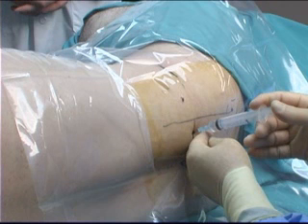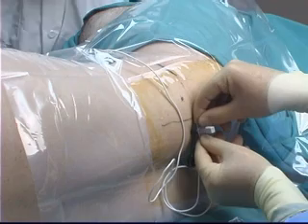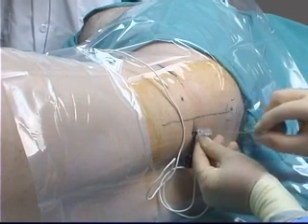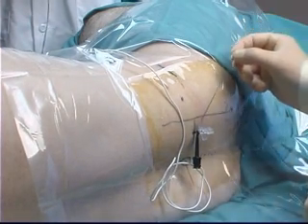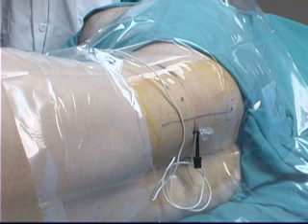This is extremely important to minimize the theoretical but dangerous complication of intrathecal injection of local anesthetic agent. Again, note the slightly medial angulation of the needle to ensure contact with the bony structures. The nerve stimulator, set to a current output of 1 to 1.5 milliamps, a pulse width of 200 to 300 microseconds, and a frequency of 2 Hz, is clipped to the 100 millimeter insulated 17 or 18 gauge Tuohy needle, which enters the skin aiming slightly mesiad.